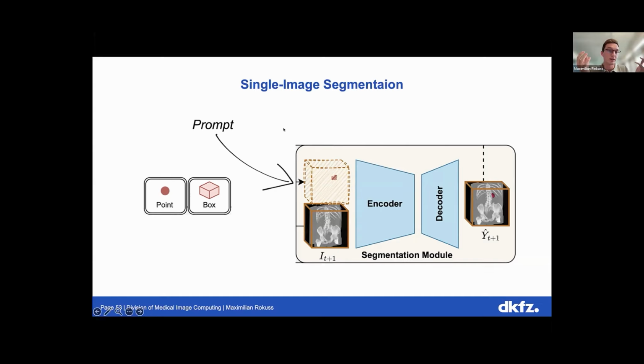And to be frankly honest, I would say that technically late prompting in latent space is probably the way to go. But just for the medical domain, where we do not have enough data, where UNets are still most of the times the state of the art, if you look at all the segmentation challenges in 3D medical imaging, we also chose to go the route of a UNet.